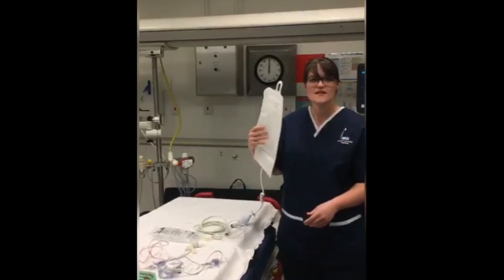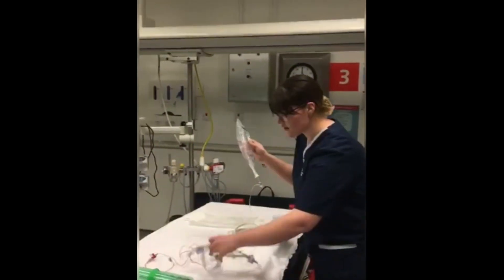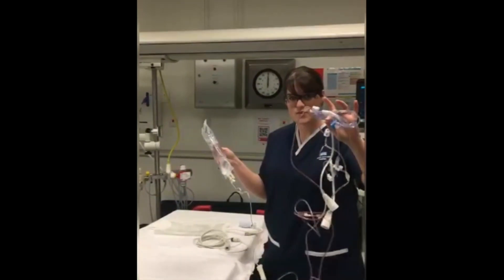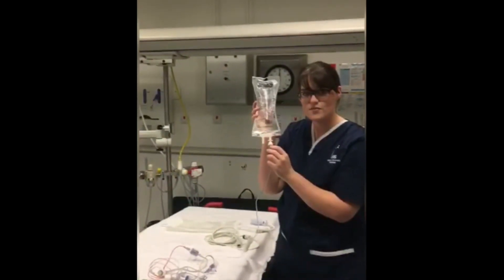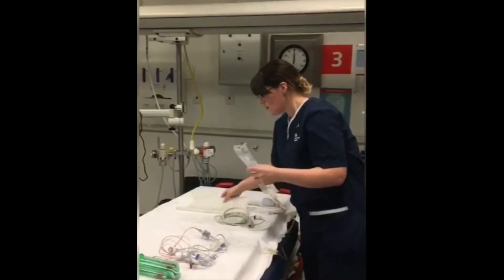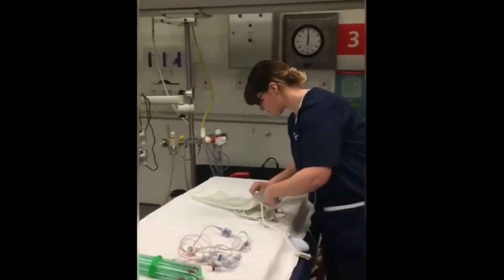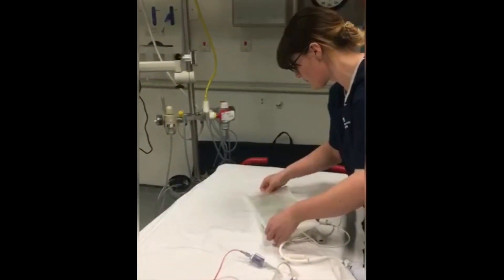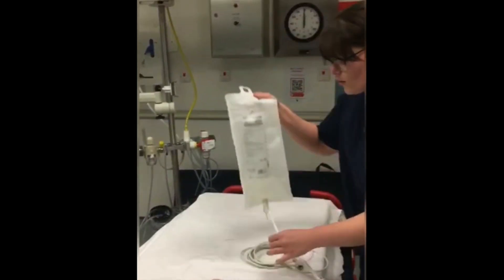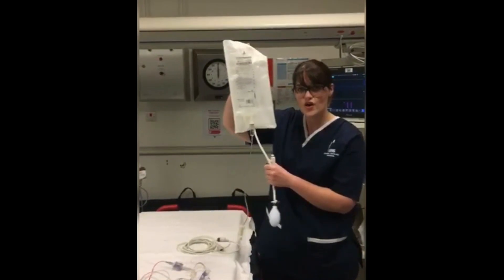Starting off, you need to make sure all your equipment is in date. You then need to get your art line cables out and place them into the 500ml bag of normal saline. You then need to pop this into a pressure bag. Once it's in the pressure bag, you need to make sure the pressure is up to 300.